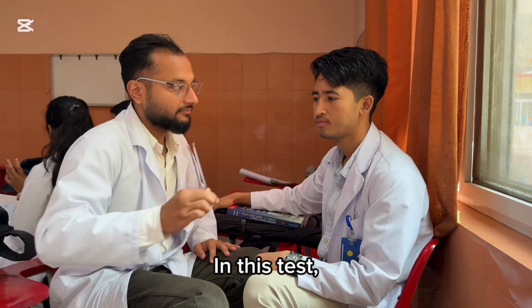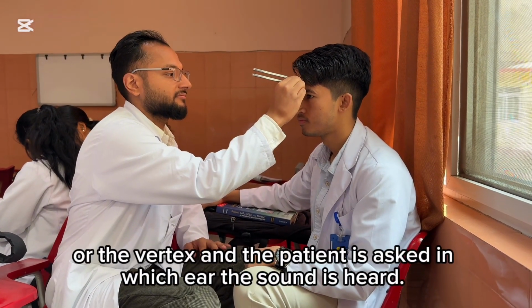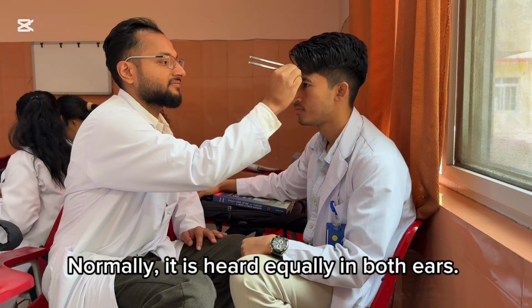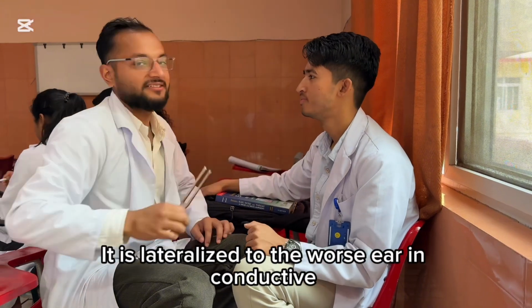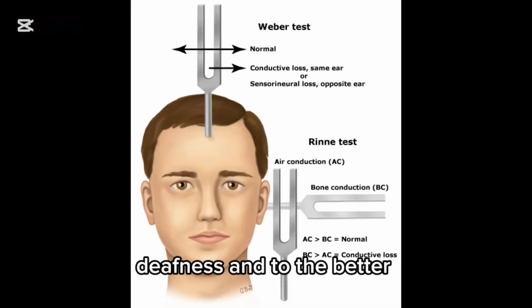Weber test. In this test, a vibrating tuning fork is placed in the middle of the forehead, or the vertex, and the patient is asked in which ear the sound is heard. Normally, it is heard equally in both ears. It is lateralized to the worse ear in conductive deafness and to the better ear in sensory neural deafness.